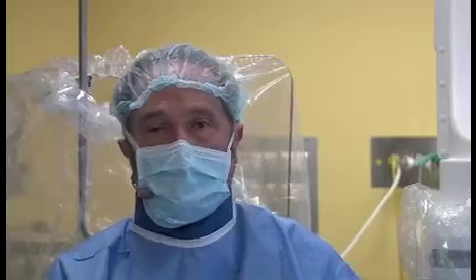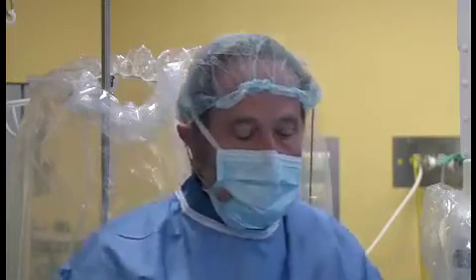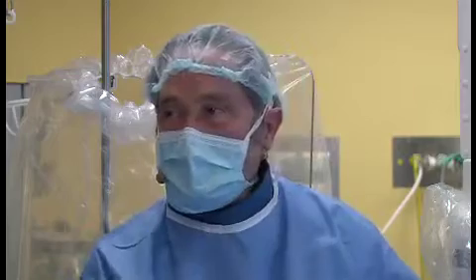Well, in this particular case, I think the risk of erosion must be very, very low, because it's a relatively small or moderate size defect with very nice definite rims, no pushing against anything. Of course, we cannot exclude this risk 100% during long-term follow-up, but I think this risk in this particular patient is going to be very, very low.